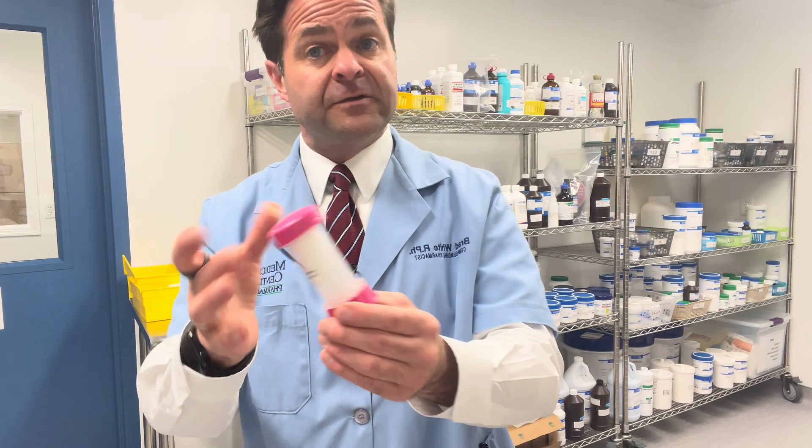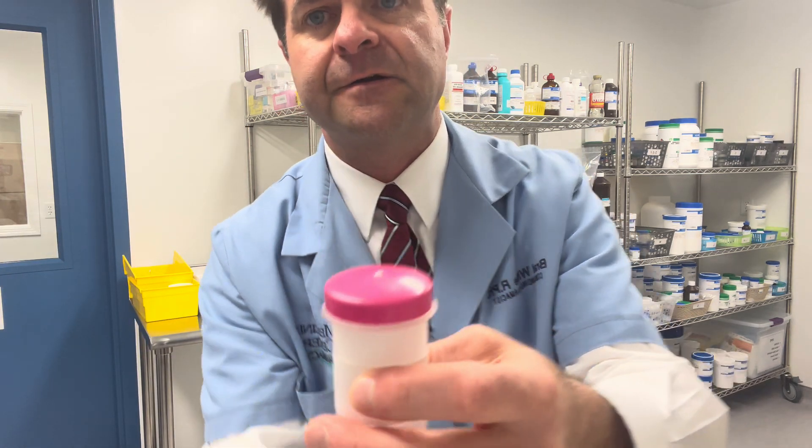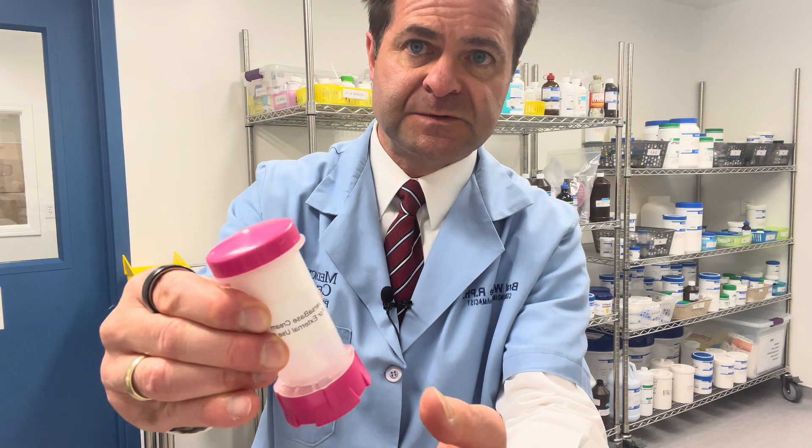So how do you use this device? You pop the tab off on the lid right here on the side, and it reveals the top of the container. This is where the medication comes out. You'll see the white cream here underneath. This device rotates on the bottom, and most patients use one to four clicks depending on their dose.